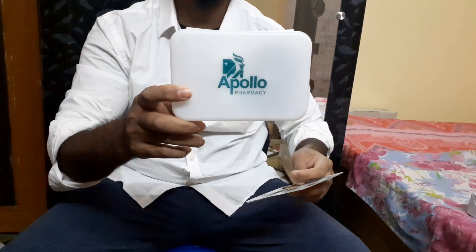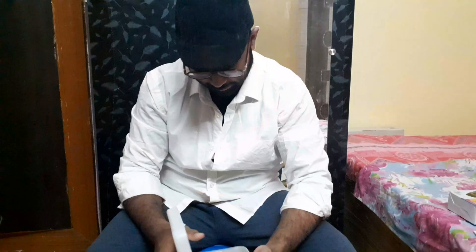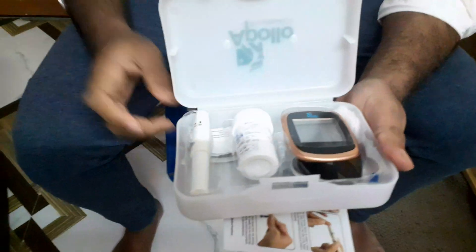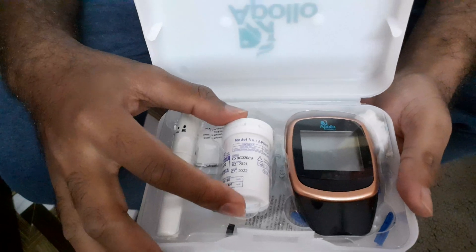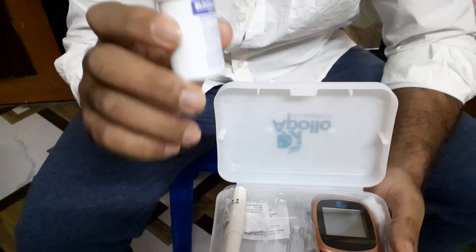Let's kick off the review. I'm going to open the package for you. This is how the device looks — this is the cover, which contains all the necessary equipment for the test. Here's what they offer: this is the actual glucometer, and you get 25 test strips here. These are the strips where you place your blood and insert it into the glucometer.